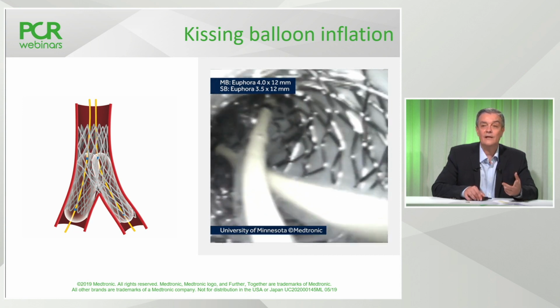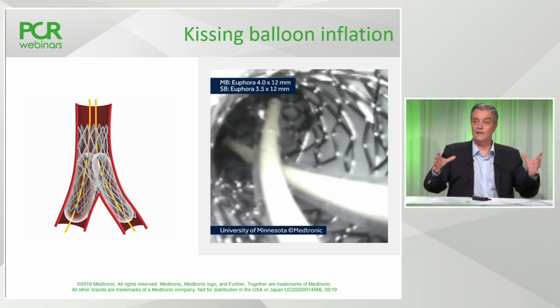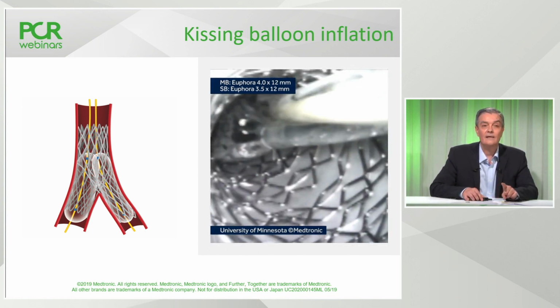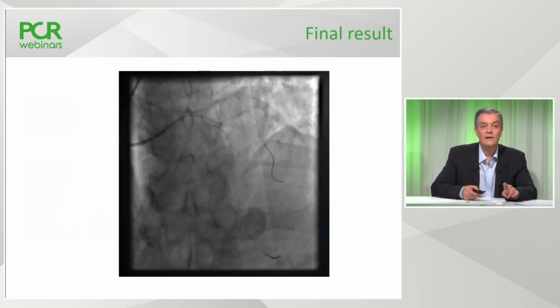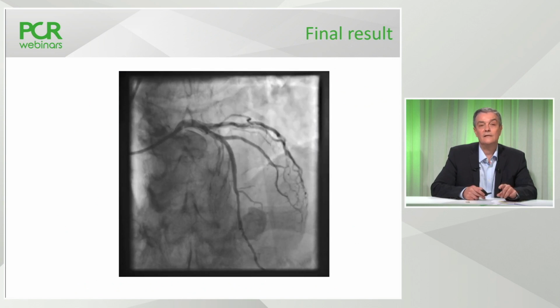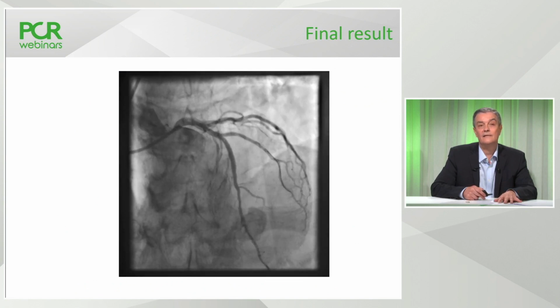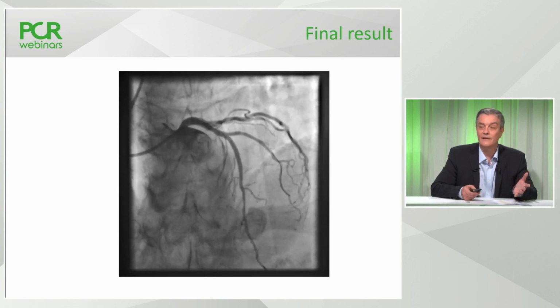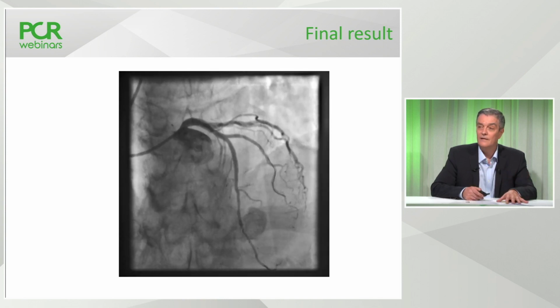And by doing that, we try to avoid elliptical deformation of the stent in the proximal part. And after this inflation, what is, Dave, the final result that you achieved? I think it really looks angiographically perfect. Yeah, looks quite nice.